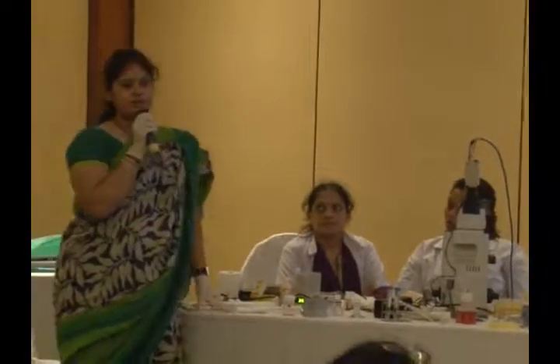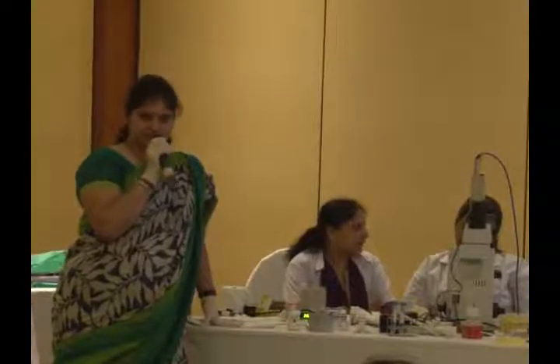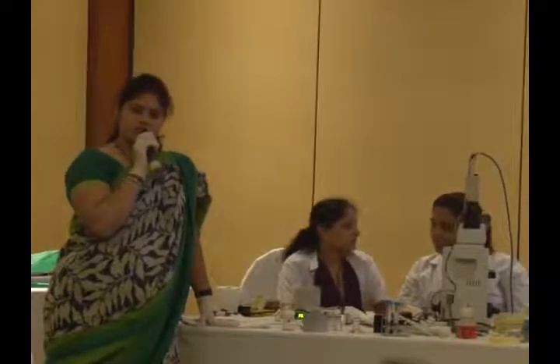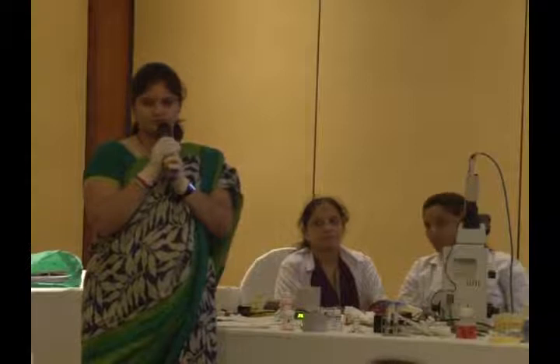See, there is one more method to do swim up. First you centrifuge the sample with the medium. Whatever pellet you get, you can put that pellet for the swim up. That way also you can do. Or first you do the swim up, and whatever supernatant you get, you can wash it afterwards. So there are two methods. Hope nobody is confused. Both are equal. You can follow any one.